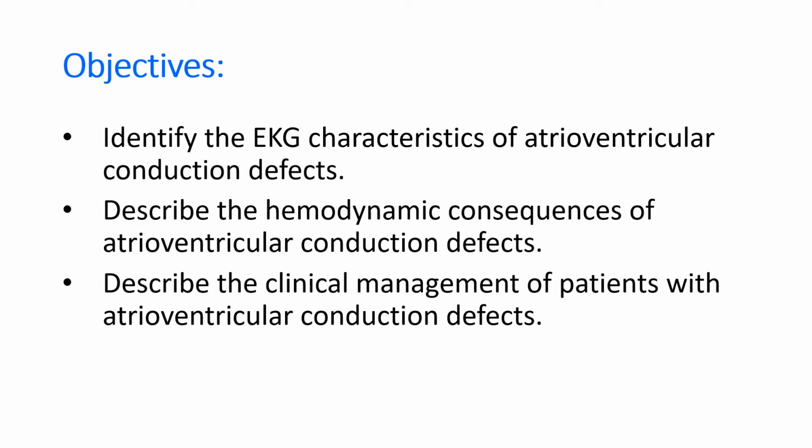In this lecture, we will be discussing AV blocks. The objectives: we're going to identify the EKG characteristics of atrioventricular conduction defects, the hemodynamic consequences of atrioventricular conduction defects, and describe the clinical management for those patients with atrioventricular conduction defects.